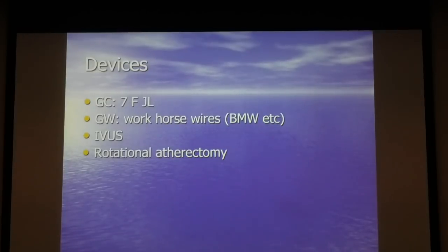90%+ of left main. We use it just very selectively. Rotational atherectomy, I think it's a must in this patient. Temporary pacemaker is a must. Intra-aortic balloon pump, no. We don't use it. We keep it on the side. Impella device, we don't use it. We don't have it. FFR.